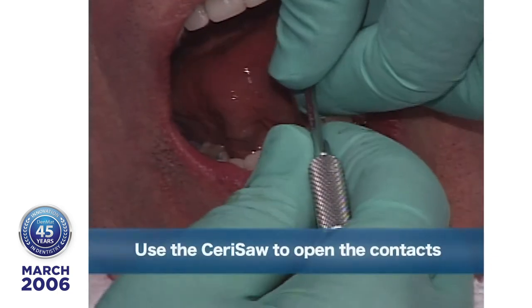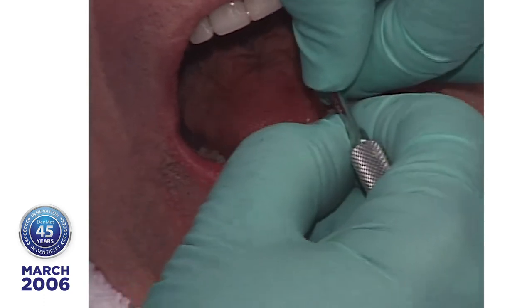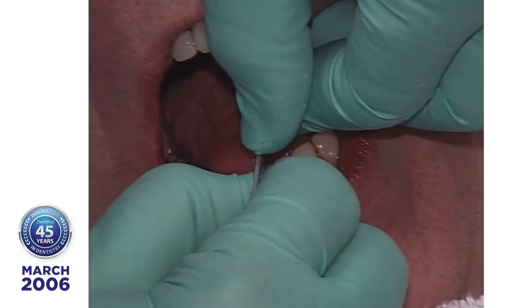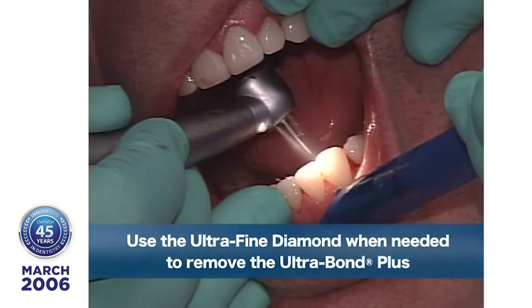Okay, now I don't like to use a lot of force on these lowers on the placement visit because there's not a lot of area. And if I use too much force, you can break them. So I'll take that long, narrow diamond again.